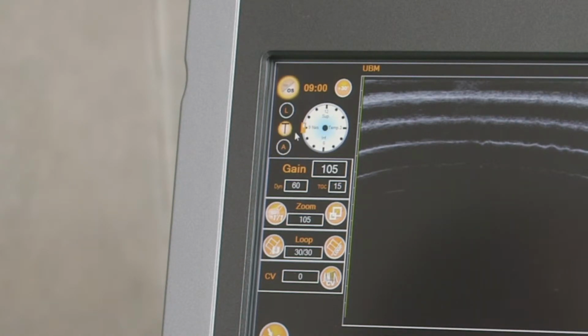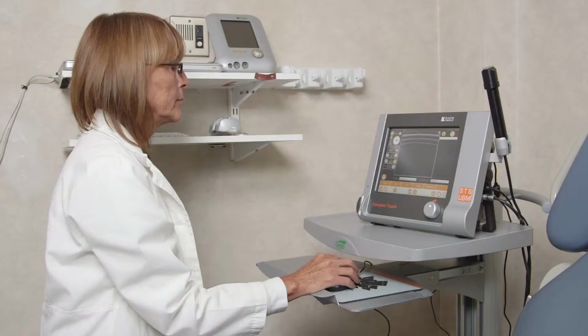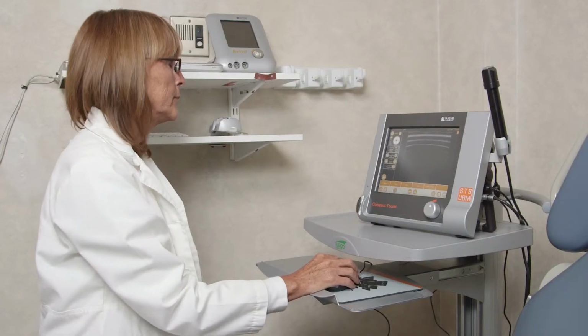For longitudinal and transverse scans, probe position on the conjunctiva peripheral to the cornea can be labeled using the clock hour. The +30 button indicates a shift clockwise by 30 minutes. While scanning, gain can be adjusted via the knob at the front of the machine, or by clicking with the mouse in the gain field. Acquired images are displayed at the center of the screen.